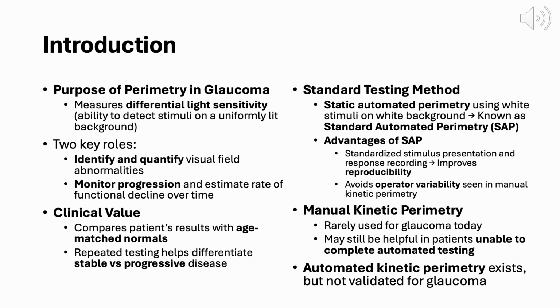Speaking of which, manual kinetic perimetry, like Goldmann perimetry, is rarely used in glaucoma today, but can still be helpful in patients who can't complete automated testing. There are also automated kinetic perimetry systems available, though they're not currently validated for glaucoma management.